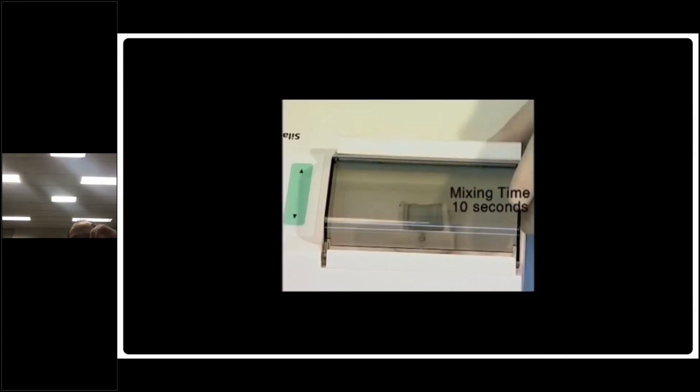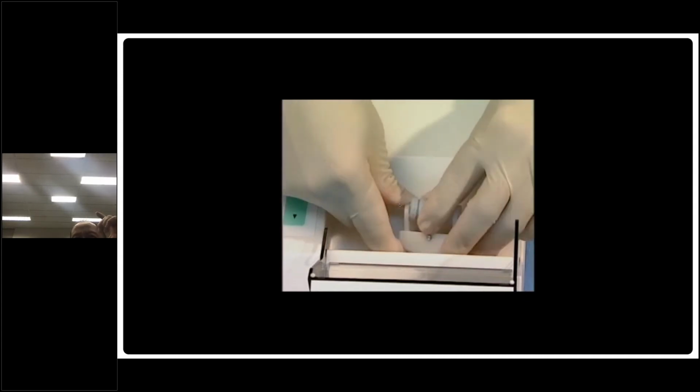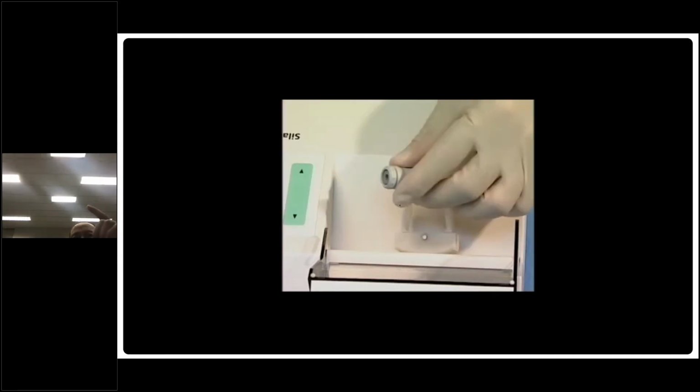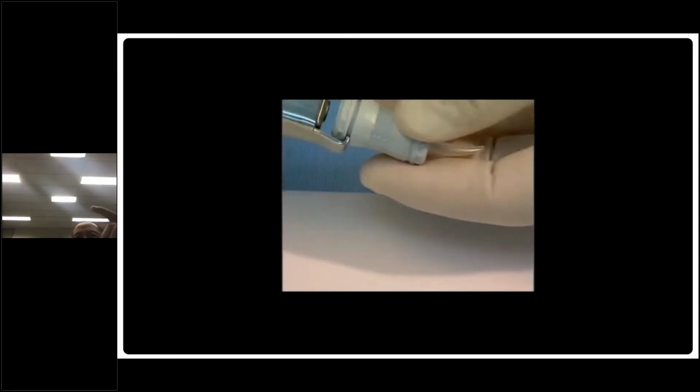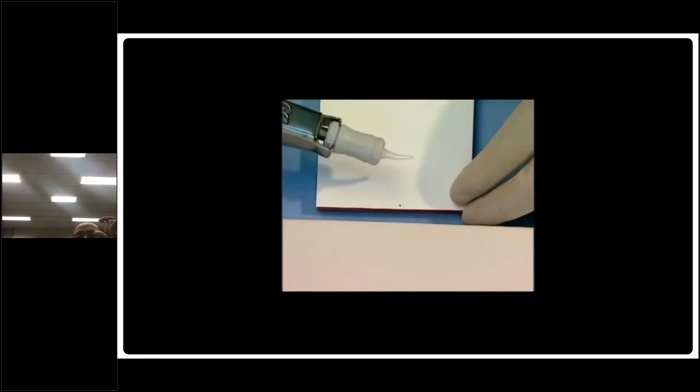And this is one key feature I want to show you that you must see on your glass ionomer cement. If you don't see this, then it was not mixed properly, or you should not use it and should really get another batch. When I first squirt out this glass ionomer cement, can you see the shininess on that surface? That gloss is essential.